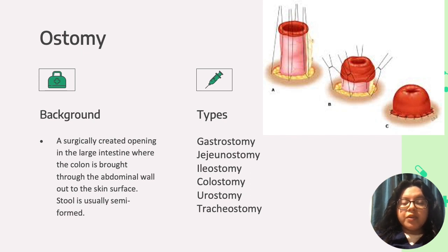When creating the stoma, they take the intestine, invert it, and then sew it in. Usually the stoma area is pink. It should be pink, red, and moist, towards the end of the inflammation after the procedure, within weeks. You should feel no pain. You will see some bleeding here or there. It's sensitive. It's within range.